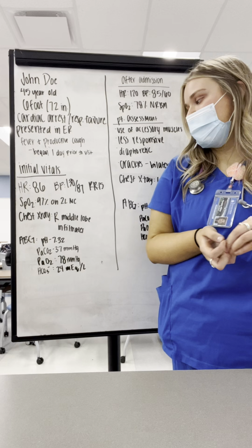I'm from the Respiratory Therapy Department, and I'm going to be presenting a case on a cardiac arrest respiratory failure patient. Our goal for this patient was to improve his ventilation and his oxygenation. My patient is a 45-year-old male who went into cardiac arrest respiratory failure.